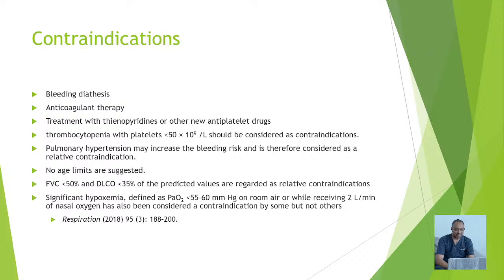Patients who have advanced airway diseases as well as parenchymal disease, such that they have a low functional lung volume, FVC of less than 50%, or a reduced DLCO of less than 35%. In these patients, be very careful, because if your patient has complications, they do not have a physiologic reserve and they are likely to get worse outcomes. Patients who have significant hypoxemia, for the same reason.